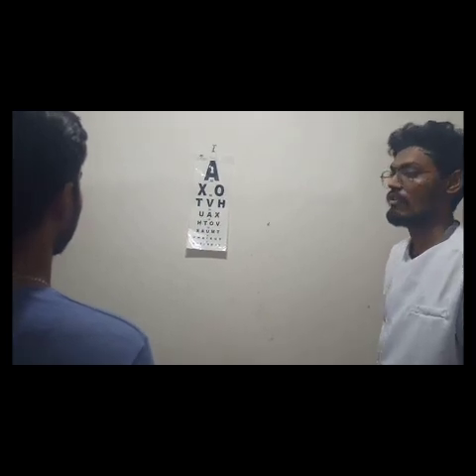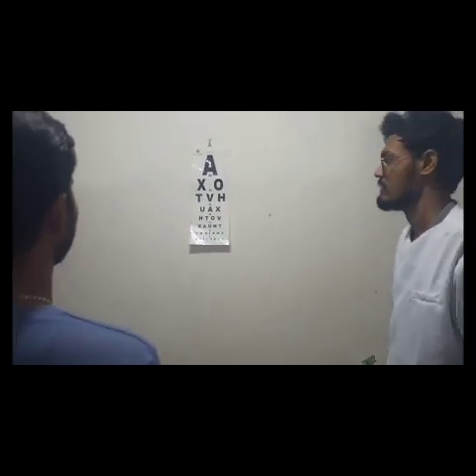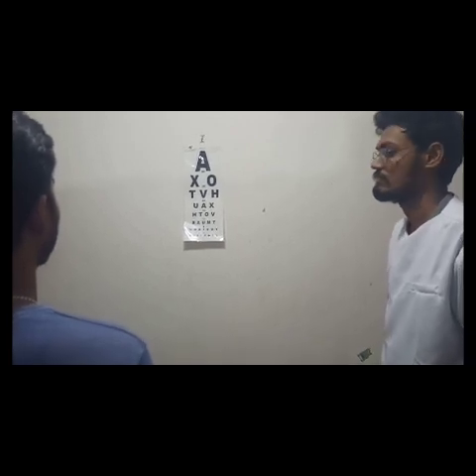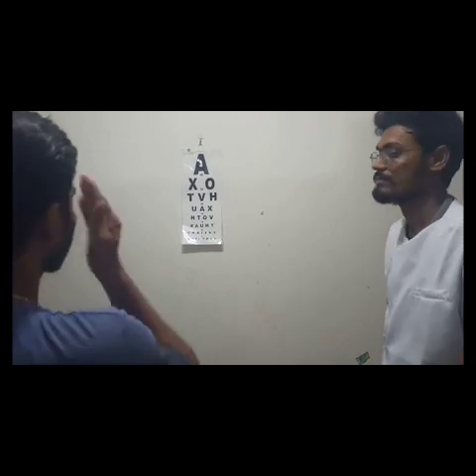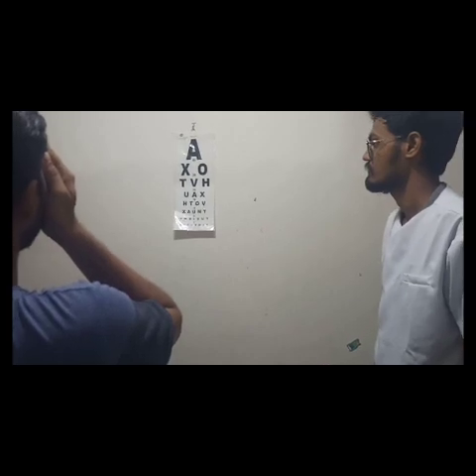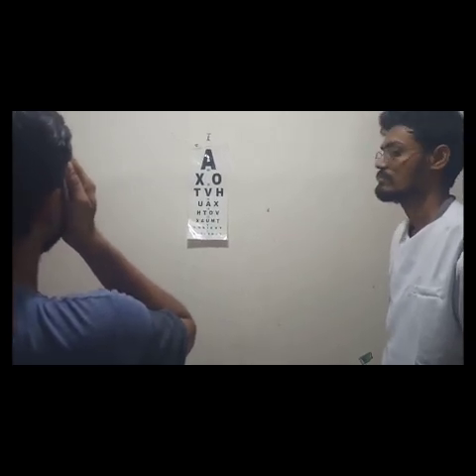Now place the patient 20 feet away and ask the patient to cover one of his eyes and read as much as possible. AXOTVHUAXHTOVXAUMT. Okay. With another eye. AXOTVHUAXHTOVXAUMTVHIIXUV.